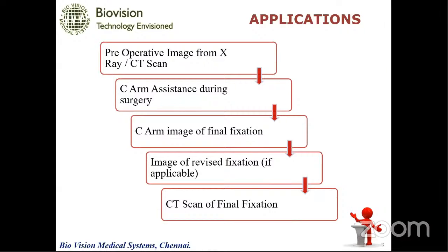But during my surgery, for example, I'm placing this metal, I'm placing this plate into the patient. If such is the case, I will not have a facility to take this X-ray machine there, and I cannot keep exposing the patient to X-ray and have to watch the film, CR or DR, whatever it is. You have computerized radiography nowadays, where you put the cassette in a reader and get the image in your system, or DR, where you get images from time to time. You put a click, and within 2 or 3 seconds, you get the image in your laptop. Yes, that is all possible.